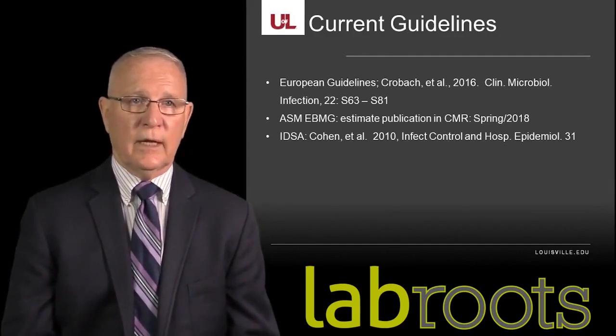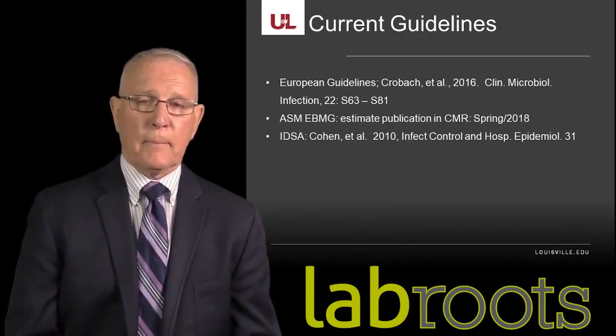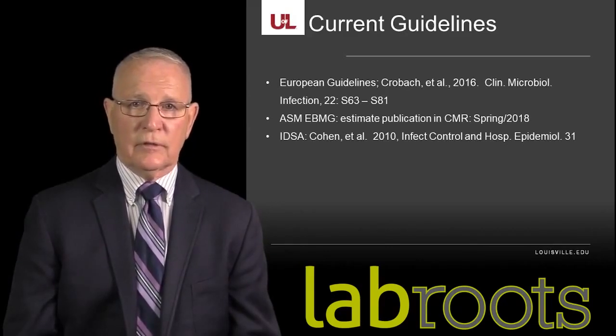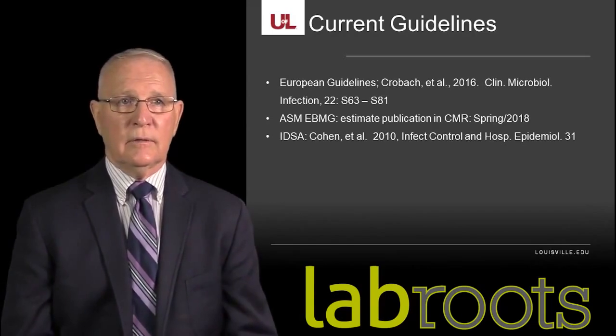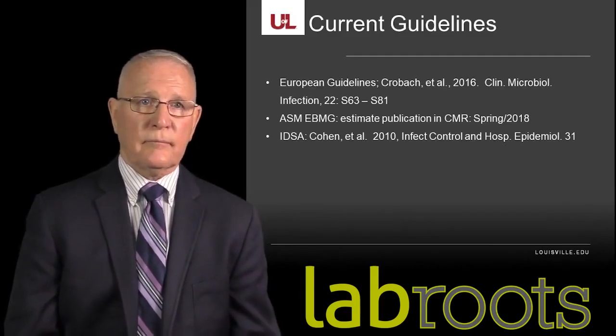So it can be used in that format, or it can be used as a confirmatory test following the 2-step algorithm involving the antigen and the toxin EIAs. Once again, the European guidelines endorse either way.